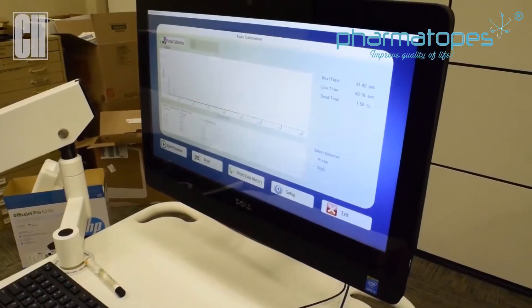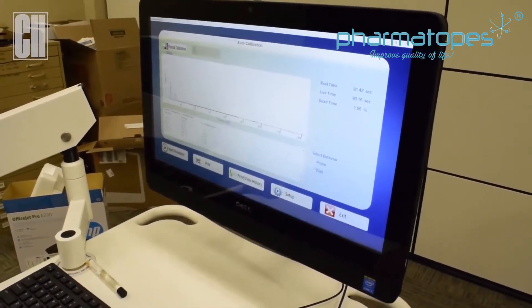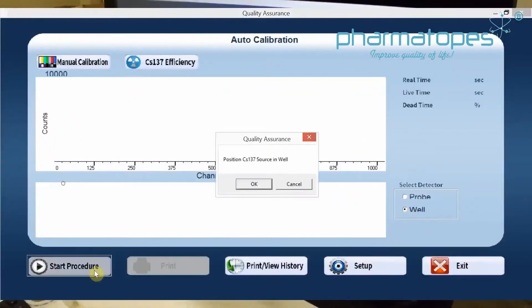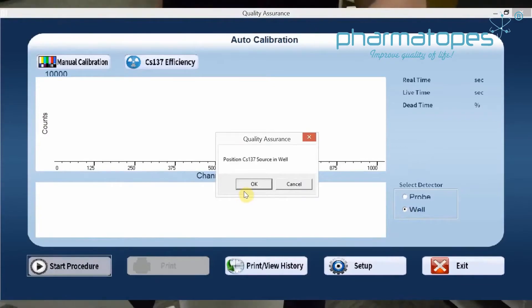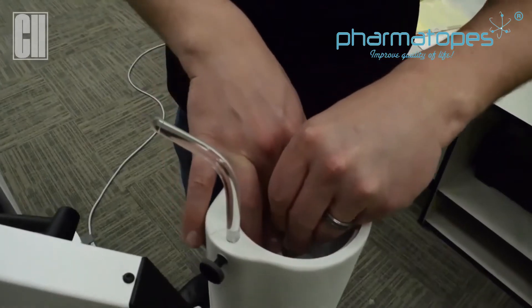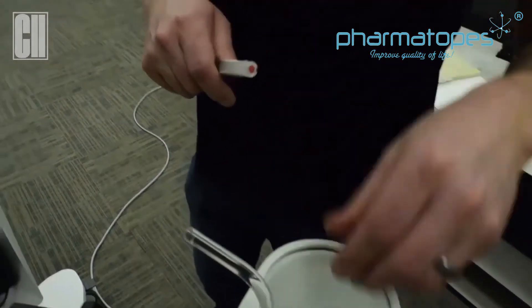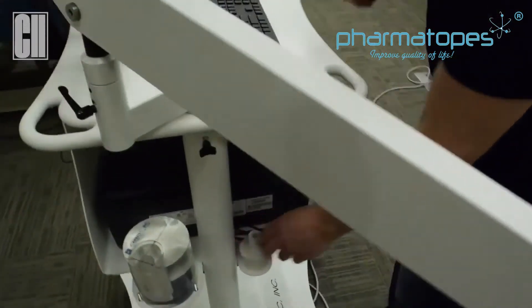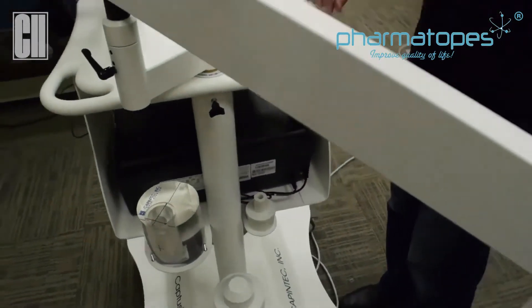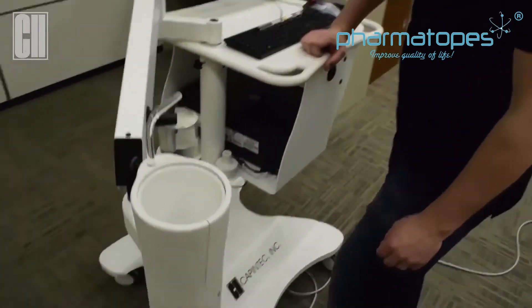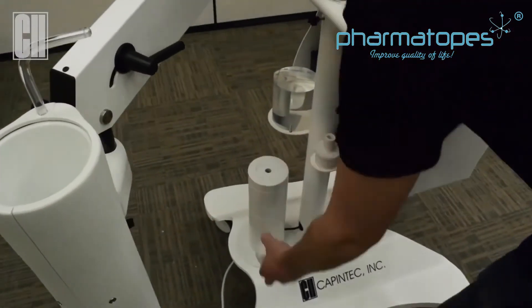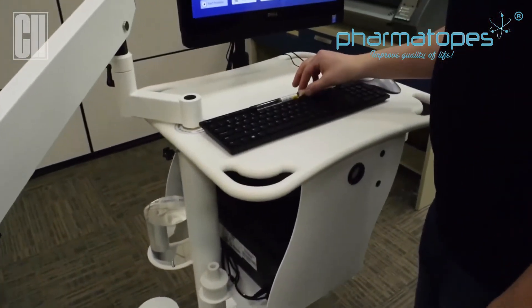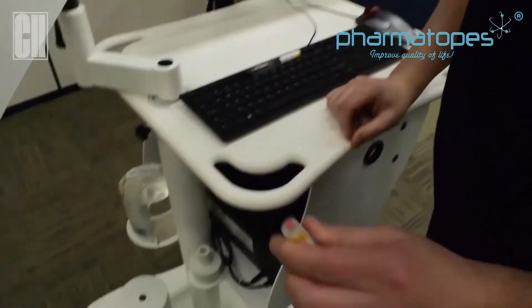Now we'll run calibration on the well. When we do Start Procedure, it's going to tell us to position cesium in the well detector. At this time, we can remove our europium source that was in our probe, and also our source holder, and put an e-holder for the time being. Now that we're calibrating the well counter, we're going to take off the top lid. We can get the cesium source and position it into the well.